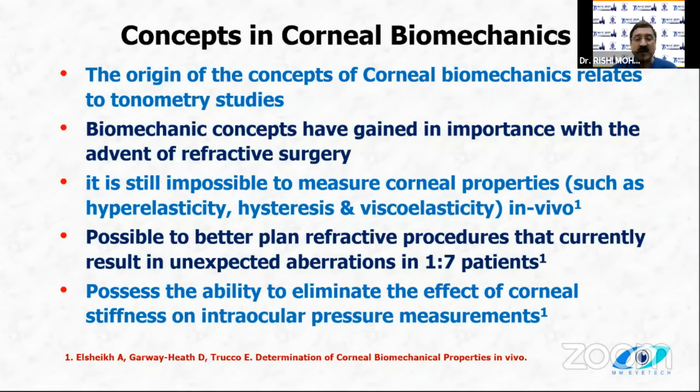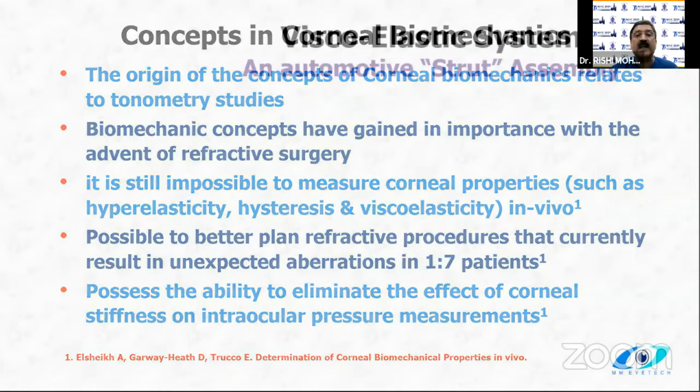Biomechanic concepts have gained in importance with the advent of refractive surgery. It is still impossible to measure corneal properties in vivo, possible to better plan refractive procedures that currently still result in unexpected aberrations. And they possess the ability to eliminate the effect of corneal stiffness on intraocular pressure measurements, which is what I will also highlight.